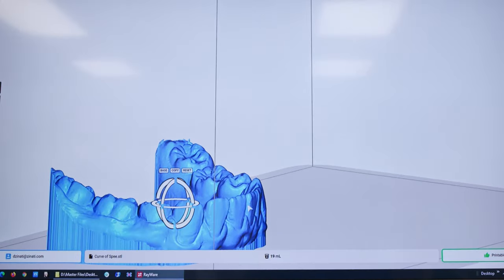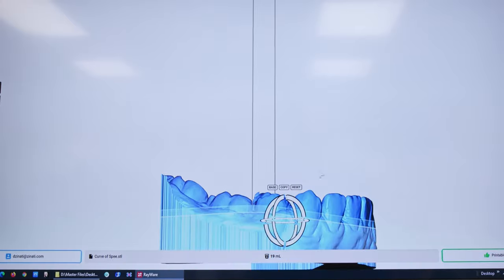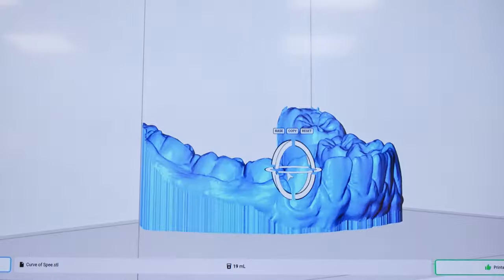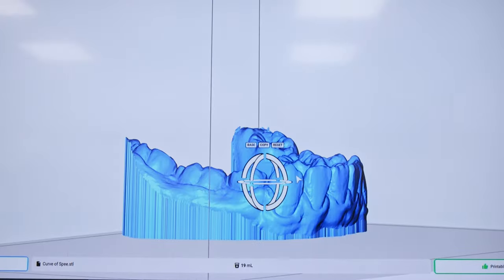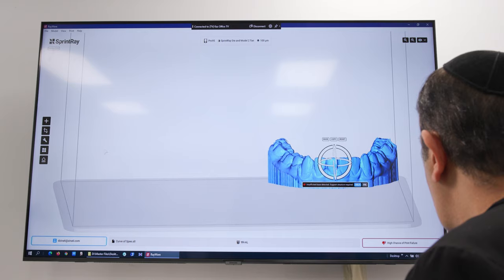Now we have a base, and if you look at this model you'll see how the back teeth — the second molar especially — are on a higher plane than the anterior teeth. When you do a thermoplastic suck-down there's going to be a difference in the thickness of the plastic from the anterior to the posterior teeth, which we don't want. So I'm going to tilt this model with the front teeth up and do a plain cut.